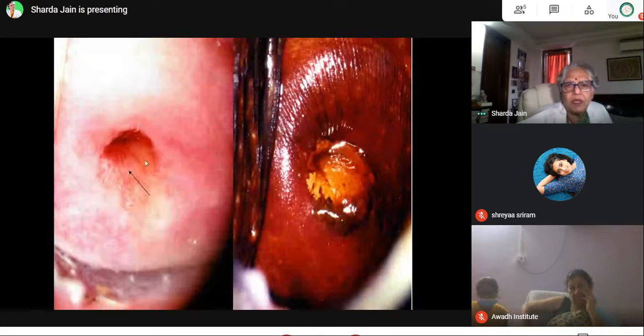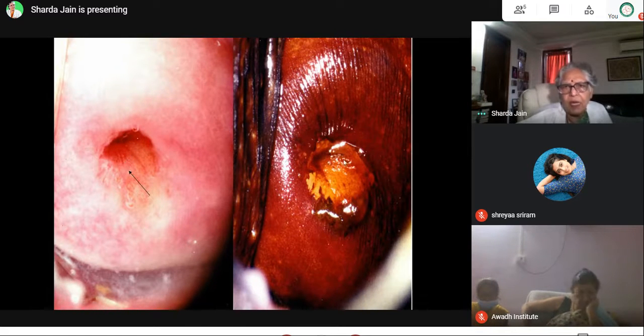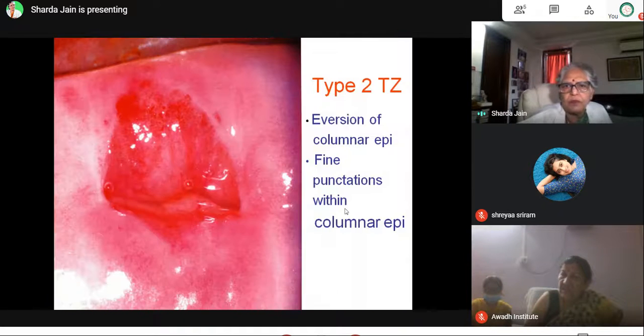And here, this particular patient had a CIN1 report, an LSIL report came, and then we could find that we could really not make up our mind after putting acetic acid. You can see the glands were here. You can see all these glands. But this became very clear after Lugol's iodine. We took a biopsy from this area and it confirmed the diagnosis.